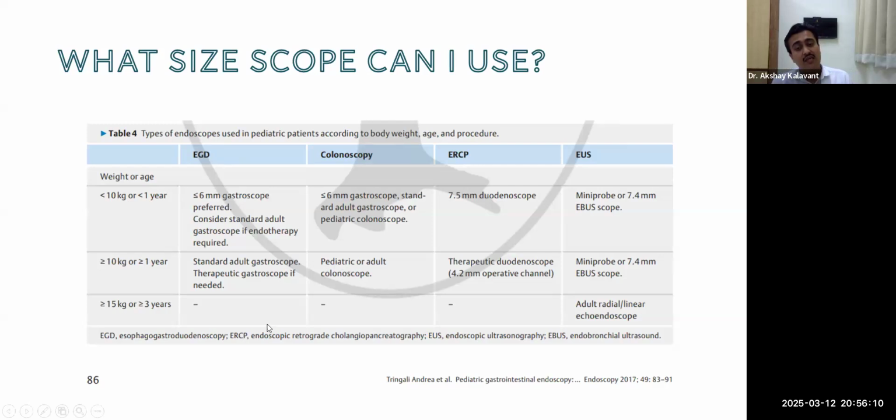I mean fragile. But the pediatric upper GI endoscope doesn't have the complete range of movement of a colonoscope. A colonoscope has movement on either side, but a pediatric or adult gastroscope, an upper GI endoscope for that matter, has only one range of movement, and the other is not very much. So that could be one disadvantage. But nonetheless, most of the time we will be able to enter even the ileum with the help of a standard scope.